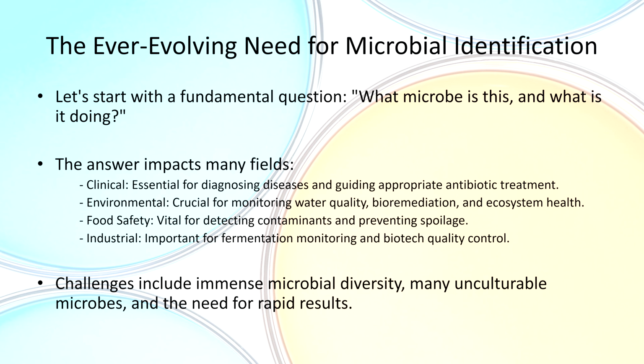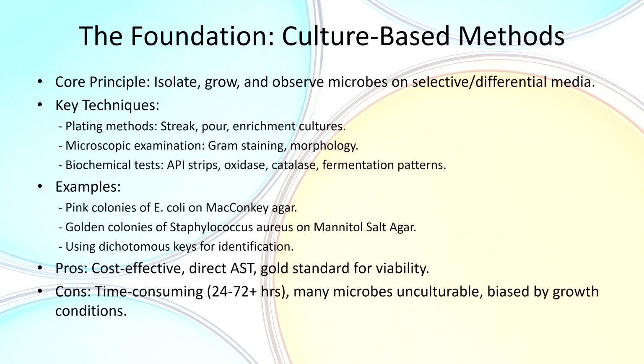Culture-based methods form the foundation of microbial diagnostics. They rely on isolating and growing microbes on specific media. Classic techniques include plating methods like streak or pour plating, microscopic examinations such as Gram staining, and biochemical tests to differentiate species. For example, E. coli's pink colonies on MacConkey agar or Staphylococcus aureus's golden colonies on mannitol salt agar are classic hallmarks.